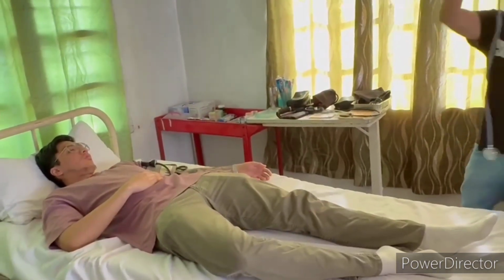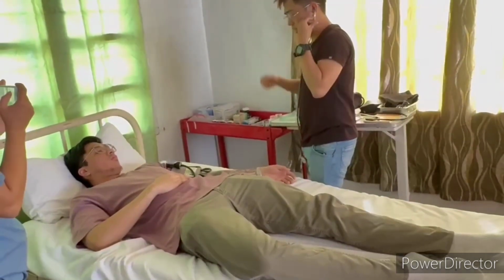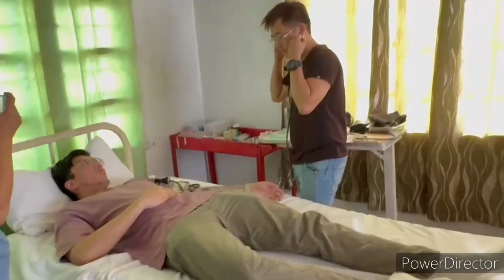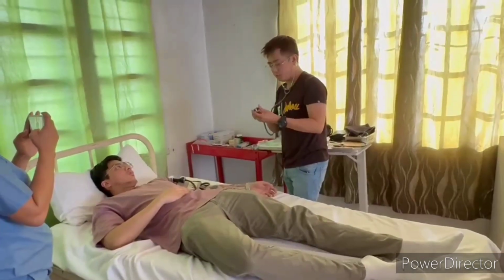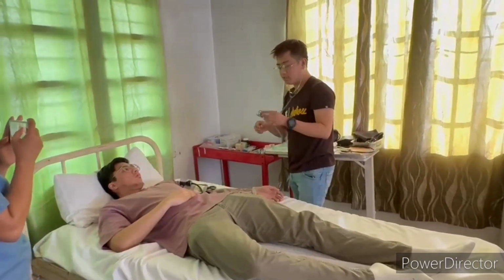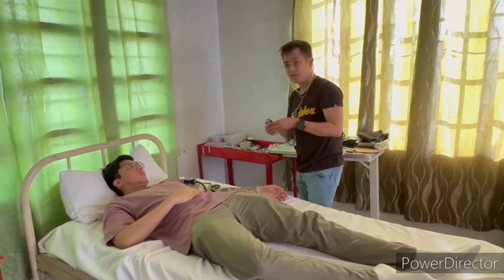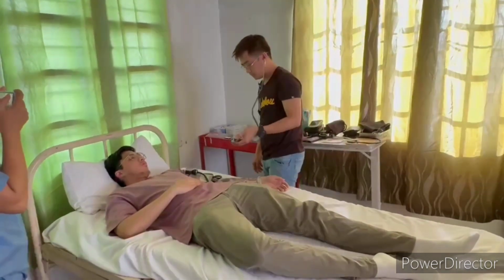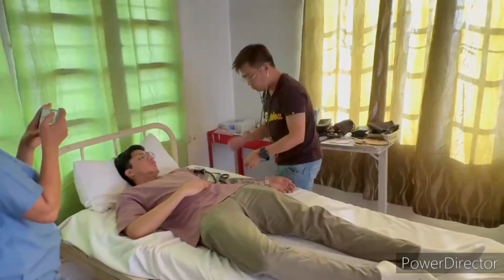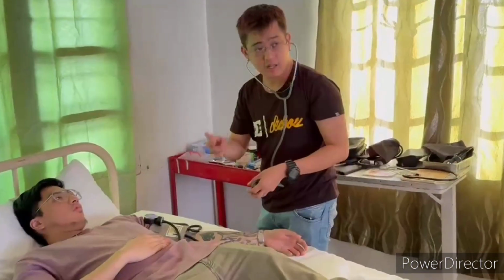Okay? After getting it, you can wear the stethoscope. And then before using the stethoscope, we have to check first if it's working by tapping the chest piece. If you hear the sound, that means it's working, so we can proceed in getting the blood pressure of the patient. Okay? So after doing that, we can now palpate the brachial pulse of the patient using your index finger and then middle finger.